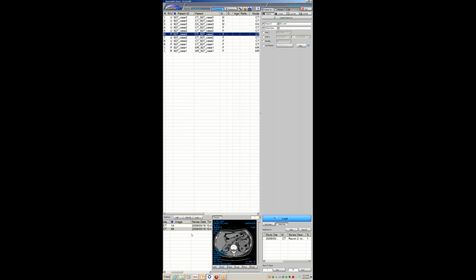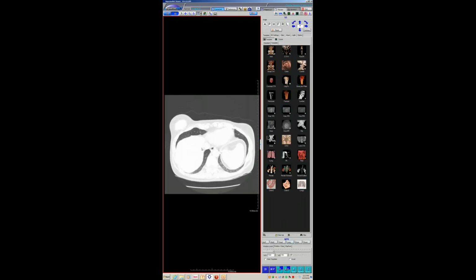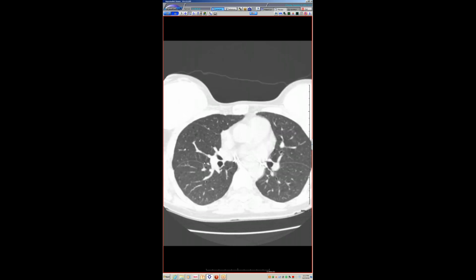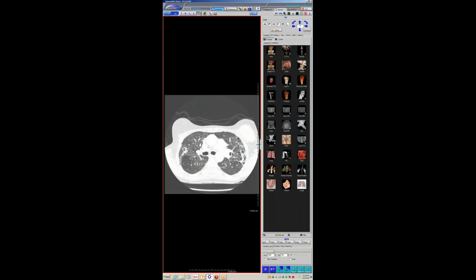And I think what you could see better, this is a CT from 2009. And I think what you could see here is that she's started to develop these little cysts. And LAM is one of the diseases that can occur after transplant. So she's developed these little cysts throughout the right lung, which had been slowly developing for years. And then she starts developing this weird process.